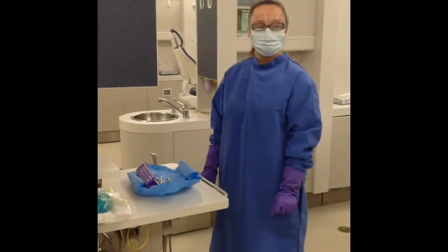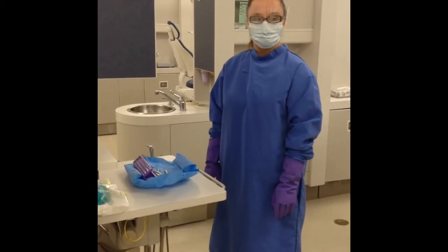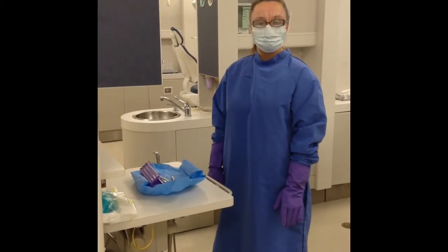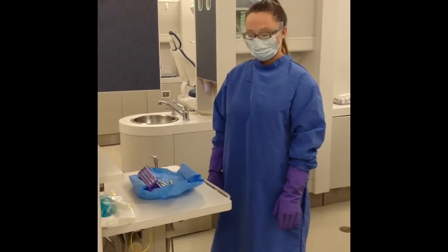Krista is our clinician today. She just escorted her patient back to the waiting area and is ready to start cleaning up her unit. The first thing she did is perform hand hygiene and then put all of her PPE back on, including her purple gloves and utility gloves.